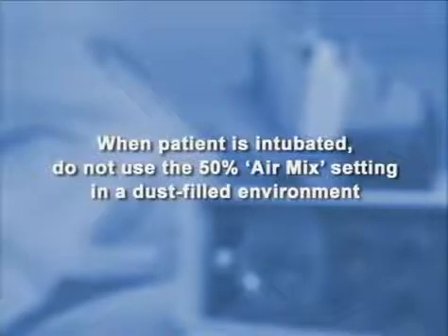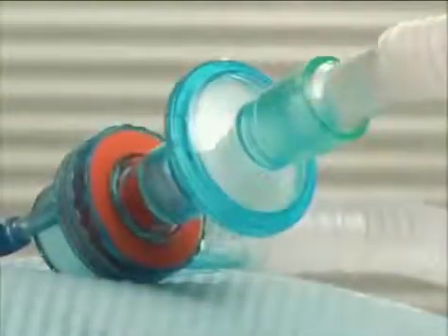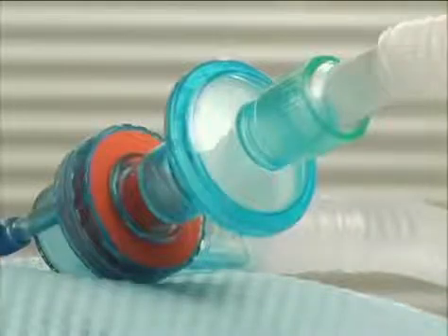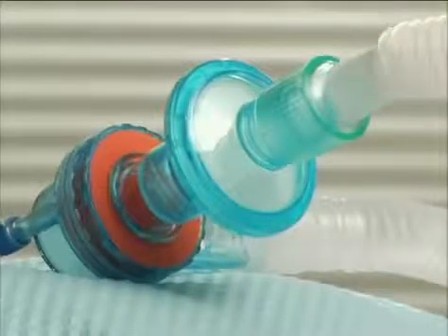When the patient is intubated, do not use the 50% air mix setting in a dust-filled environment. This could contaminate the patient's lungs. You can avoid this problem with bacterial filters, which also act as HMEs, heat and moisture exchangers. This is why Smiths Medical strongly recommends using such devices when you ventilate intubated patients, at least for long-term ventilation.